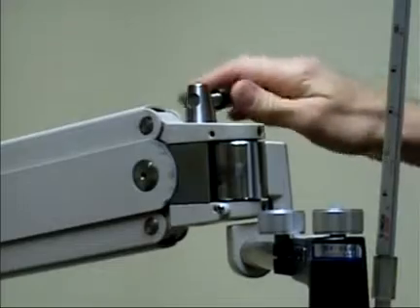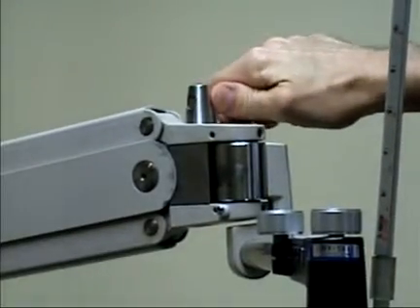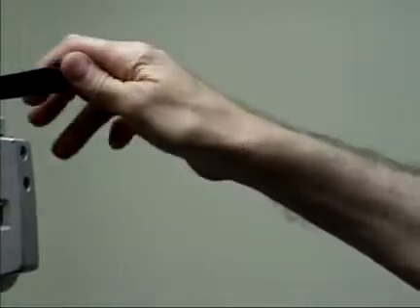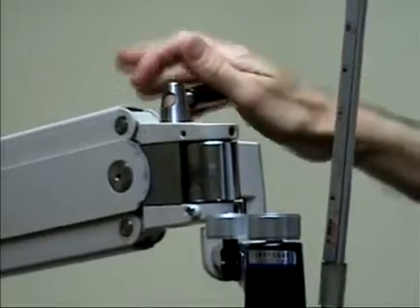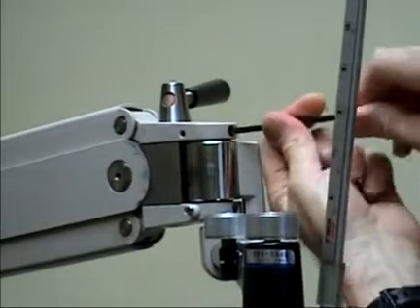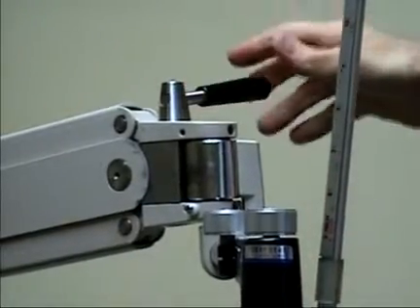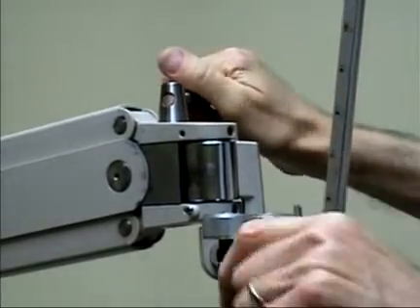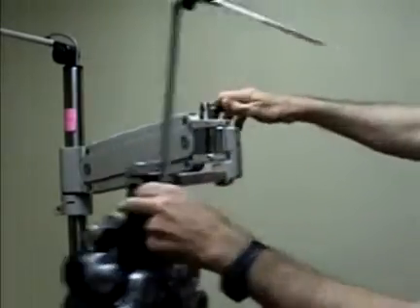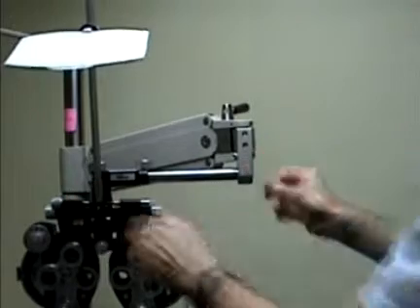The other extreme is when the cylinder is pulled so close to the tightening mechanism that when you tighten the lever to lock it, a lot of times it will bounce back. In this case it's holding the adjustment, but often when it's this tight a movement it's difficult to move the arm around. The whole arm is difficult to move — it's actually too tight in this configuration.